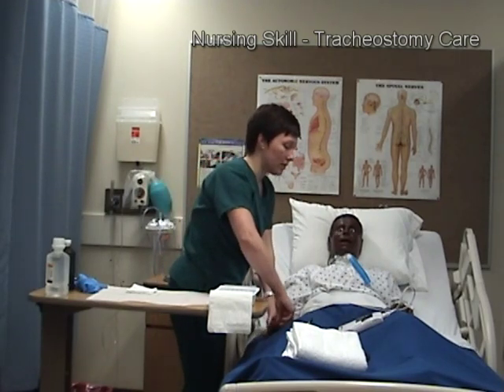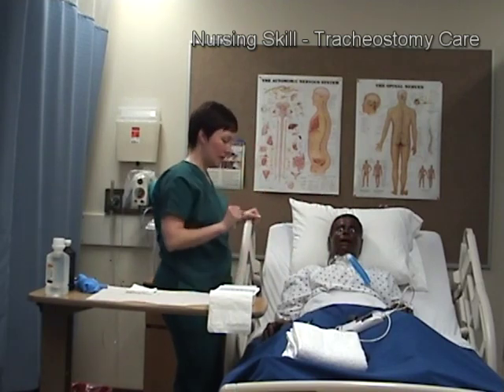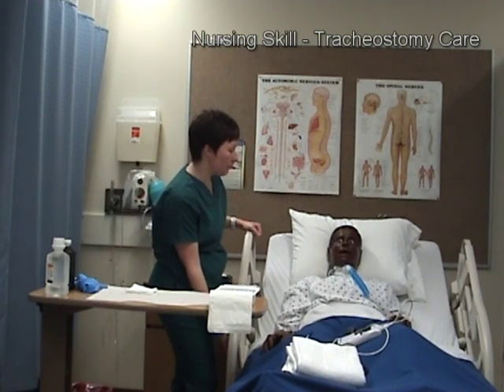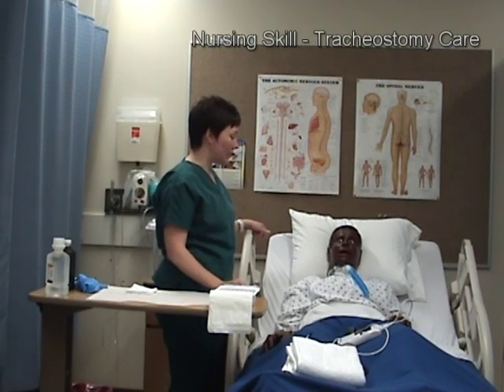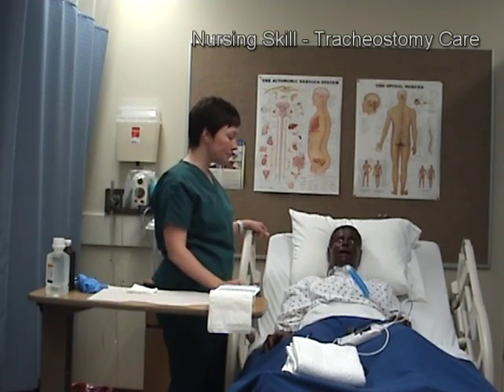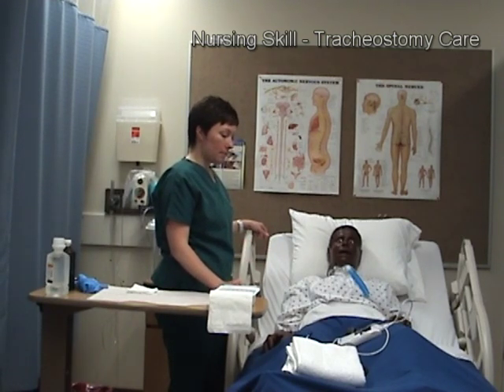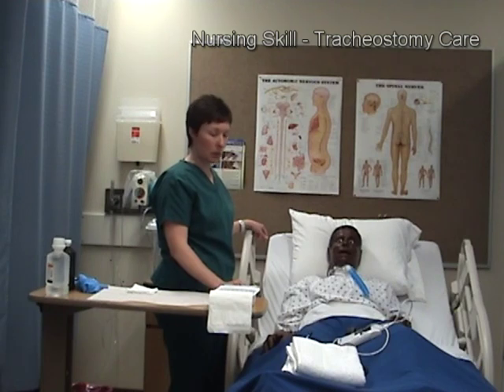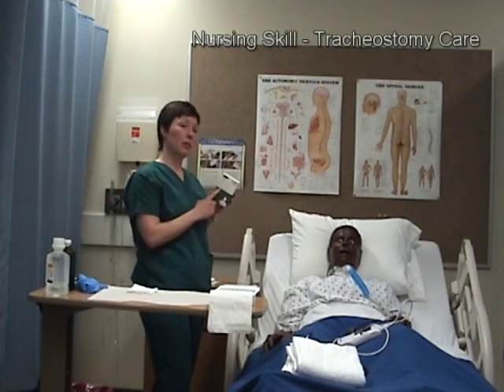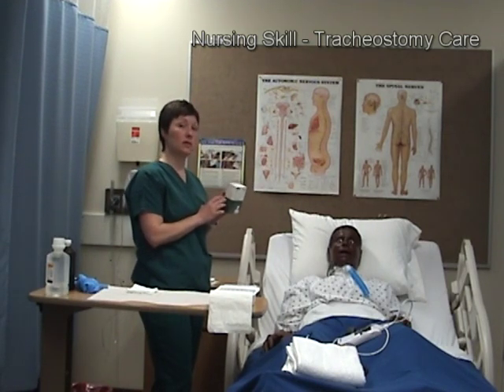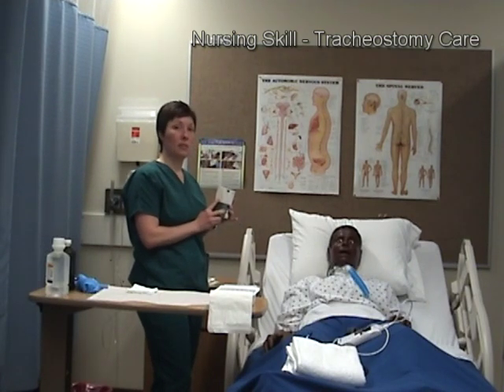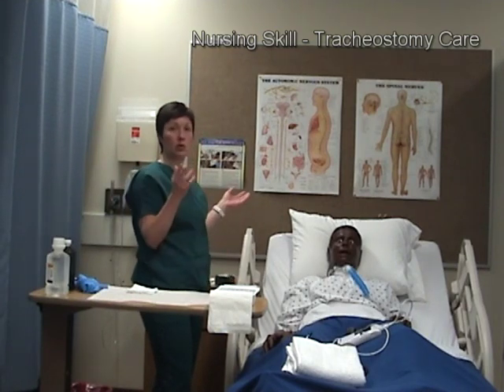Once documentation is done, I'll ensure that the bed rails are up, the bed is in the lowest position, and the patient's call light is within good reach. I'll check patient comfort, collect my supplies, and throw out what I can. The extra supplies I brought in will likely need to stay in the room per agency protocol, as some agencies don't want you taking items in and out of the room — these may be kept for emergency purposes.